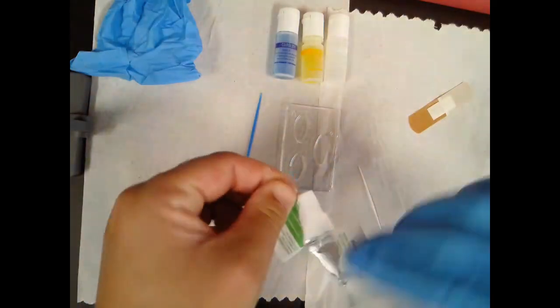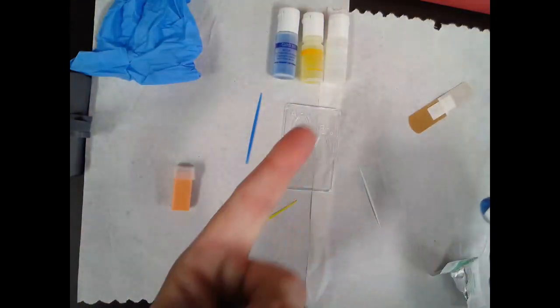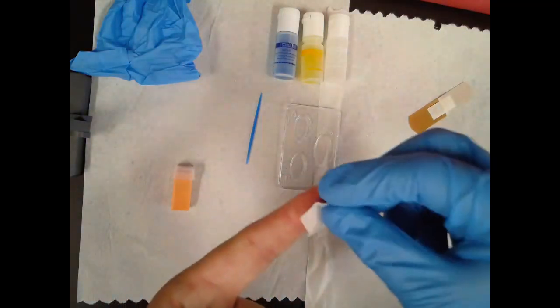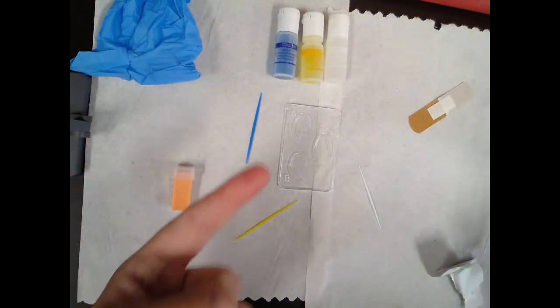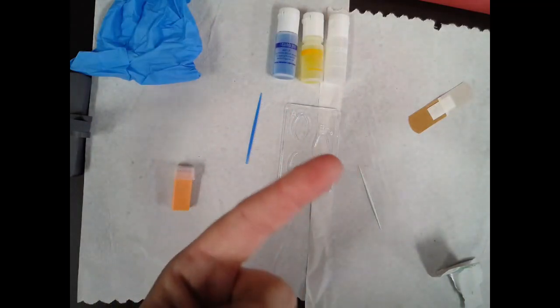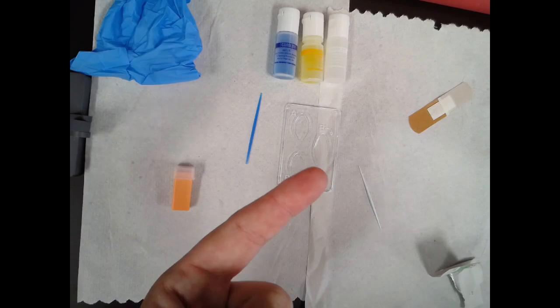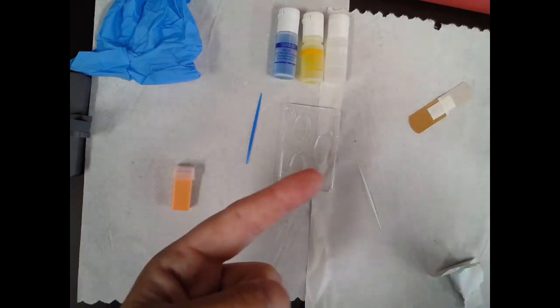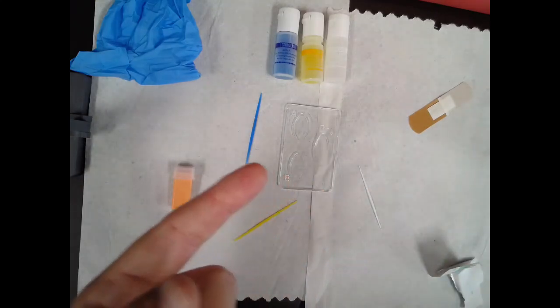First, let's open up the alcohol swab. I'm going to use my left index finger. Do not blow on your finger to try to dry it because that will defeat the whole purpose of trying to disinfect your skin in this area because you'll blow bacteria on it. So just give it a moment, let it air dry.